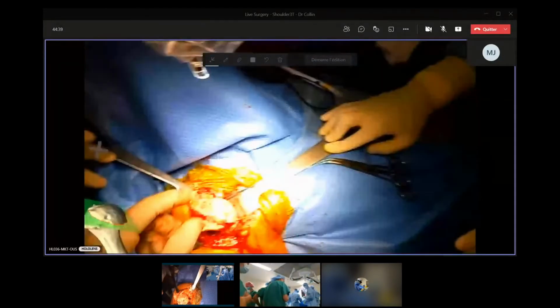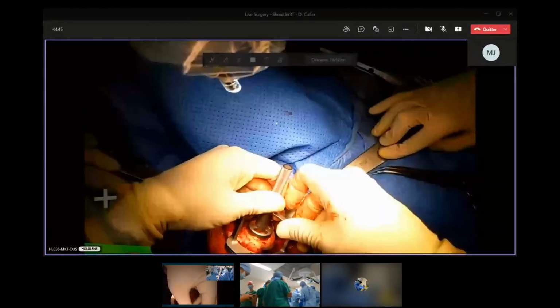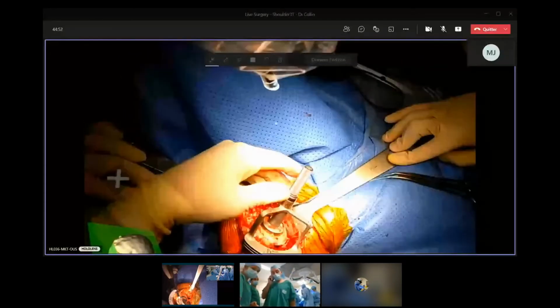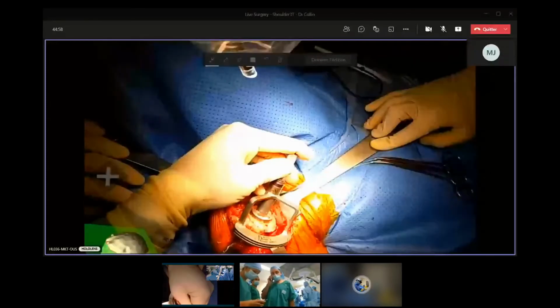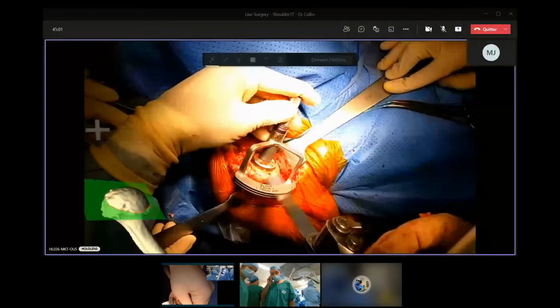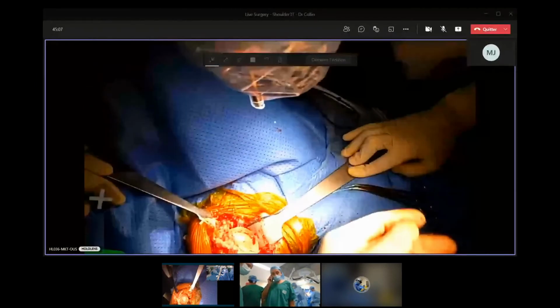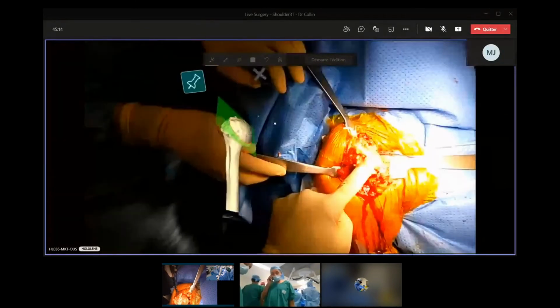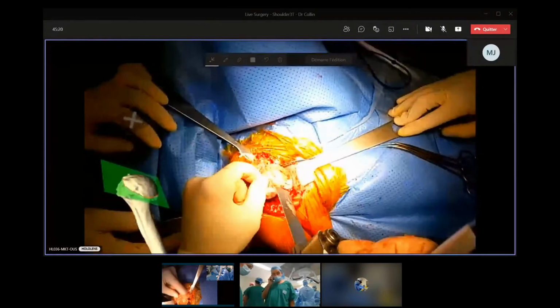So now we're going to take the graft. Maillet. OK, d'accord. So I'm just taking the graft now. OK, this is my graft. I will use it later. So now you remember your HoloLens, your hologram is here. My head is here. So I'm going to make my cut. I just check.